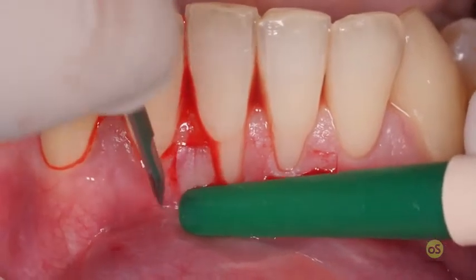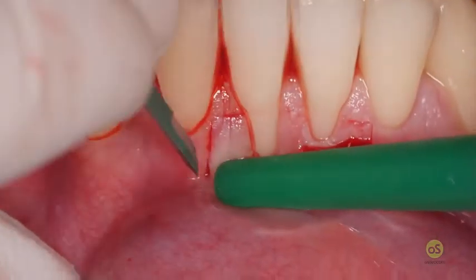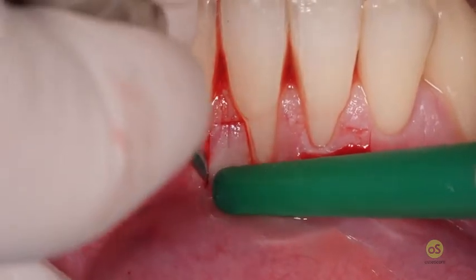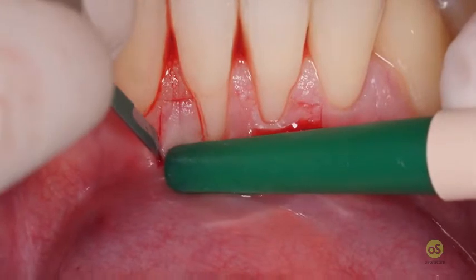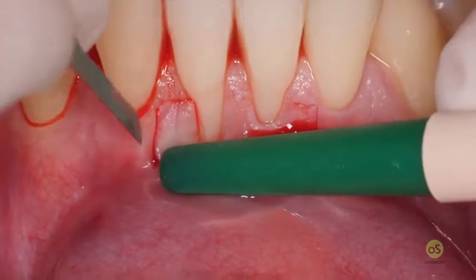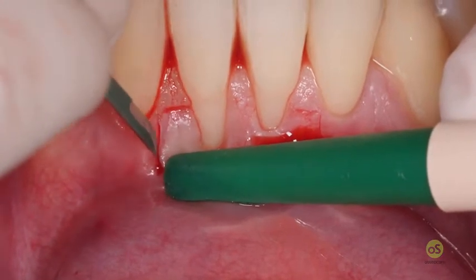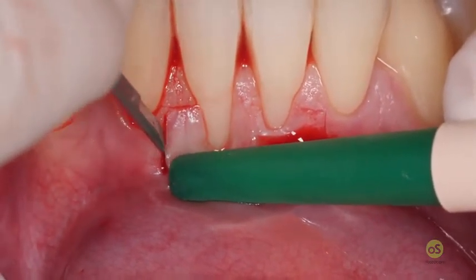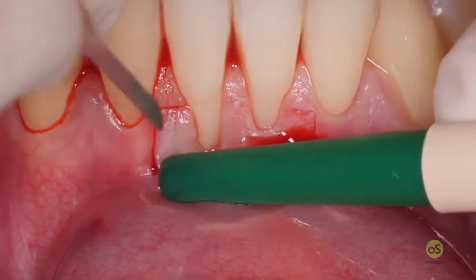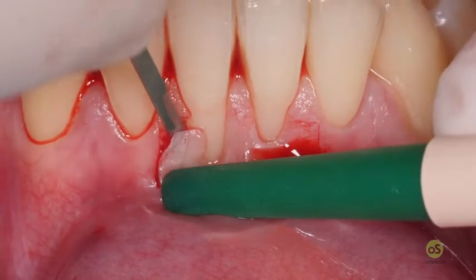I want to see very, very well where to increase the length of the vertical release incision, to bevel this incision, until the whole papilla is elevated with the right thickness, right shape.